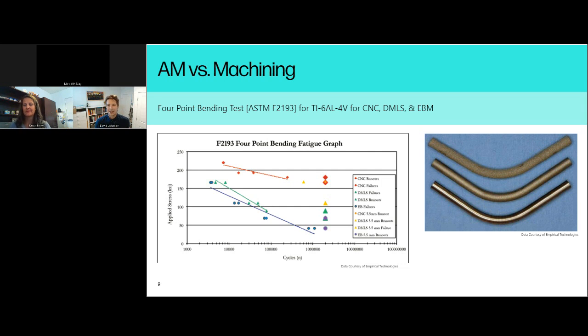Okay. Very good. So I do want to make sure we have enough time for Meredith. So there is a question, and those of you who are asking questions will have time at the end. But this one was specific. You mentioned it a little bit in the intro, but they asked, how would material coupon testing best be addressed for the application where there are different structures? So they might have an example of a spinal implant where parts are machined versus latticed, where there might be bone contact. So how does that approach happen with the actual mechanical testing behind it?